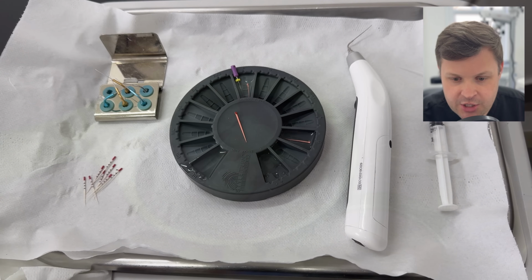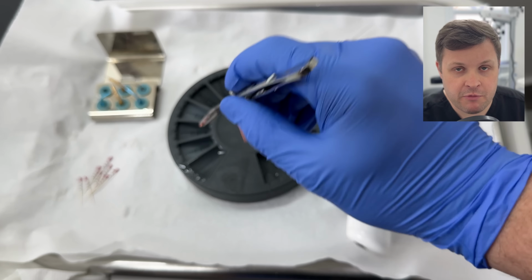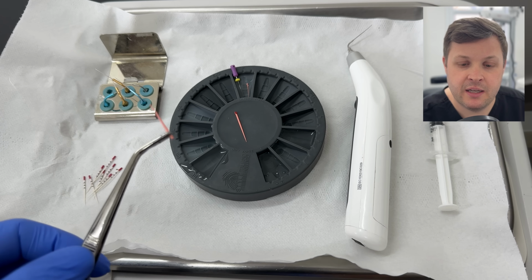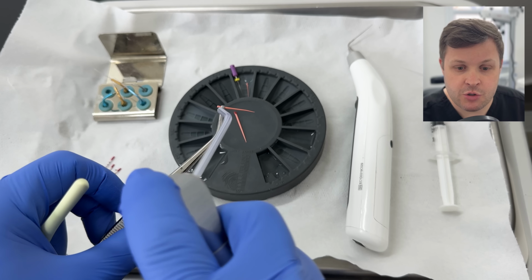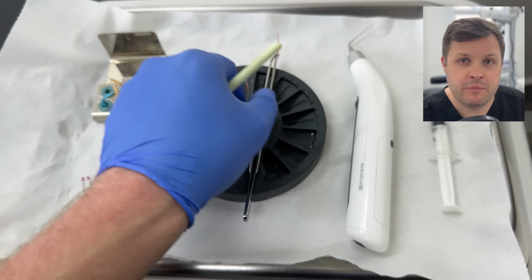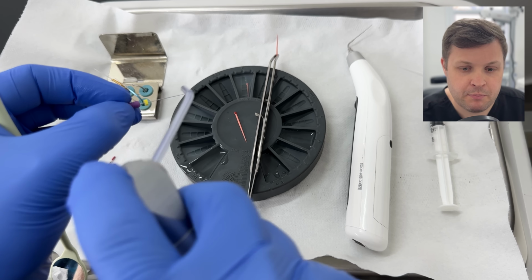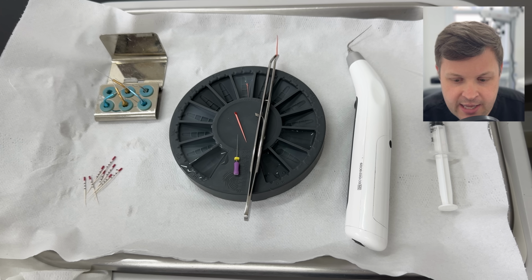So as you know, I like to prepare everything. I like to prepare the GP cone first. We're going to dip that in isopropyl alcohol, get rid of all the residue of the sodium hypochlorite off this GP cone, and we're going to just air dry it. We're then going to crimp the tweezers, and we're going to place that to one side. We're then going to prepare our hand file again. You could dip it in sodium hypochlorite, but in this case, I'm just going to blow off the sodium hypochlorite and just air dry it.